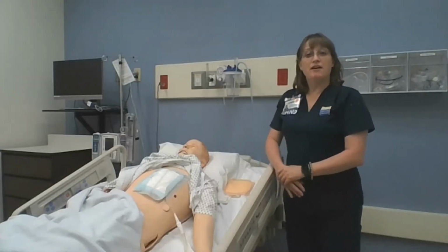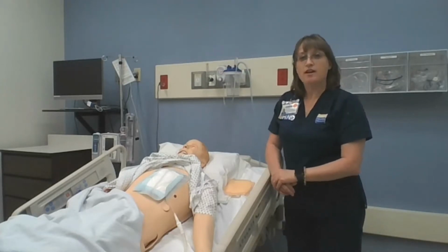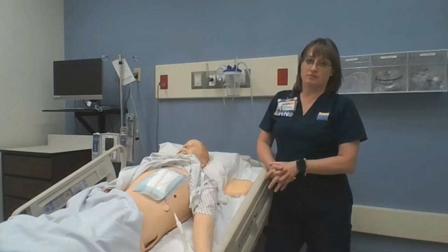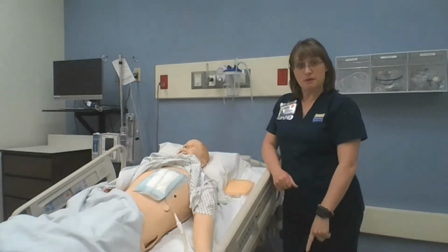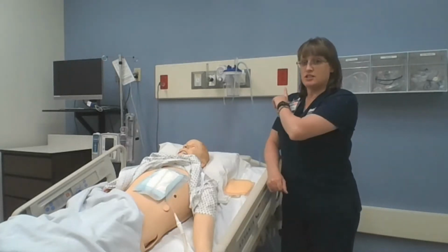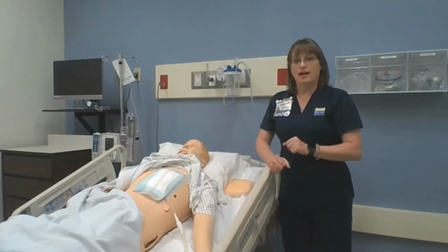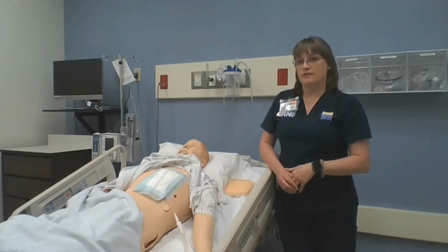So we're going to talk about chest tube assessment and what do you assess when you have a patient with a chest tube. So what do you think the very first thing is that you're going to assess when you have a patient with a chest tube? Typically at this point, I'm going to assess bubbling. I'm going to assess the suction. I'm going to assess the tube. And all of those would be things that you'll want to assess, but not the very first thing.